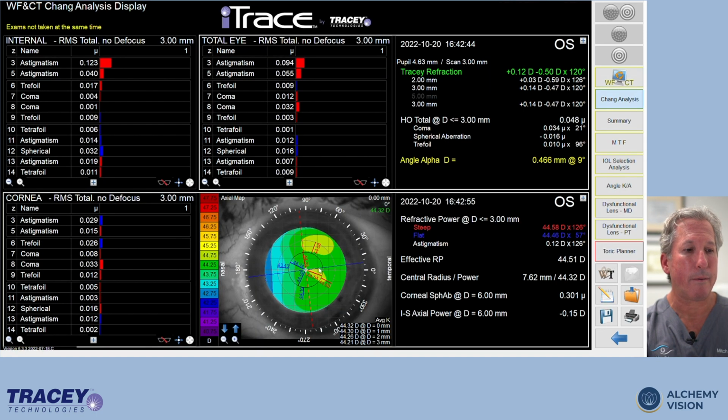And now you can see that when we've treated the patient, their cornea is much more regular, and now they're ready for surgery. And as you can see, they have almost no astigmatism based on the fact that we've now managed their dry eye. So when you're seeing a patient, if you see irregularities to the cornea, you have to think about the different things that might cause that irregularity. Dry eyes, anterior basement membrane dystrophy, corneal scarring, pterygiums like we talked about in the last patient. These are all things that are really important. But dry eye is one of those things that we can treat fairly easily and aggressively with eye drops, but we need to do that, and then we need to reassess the patients before we do cataract surgery.